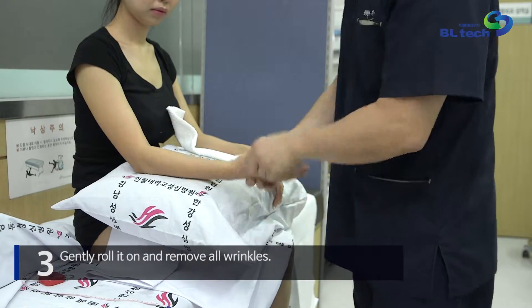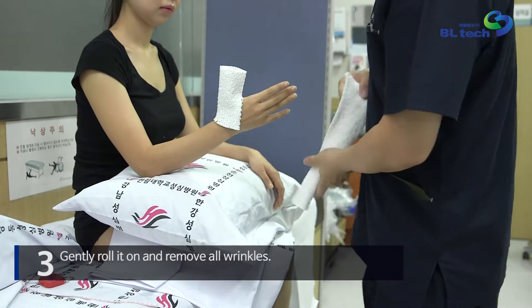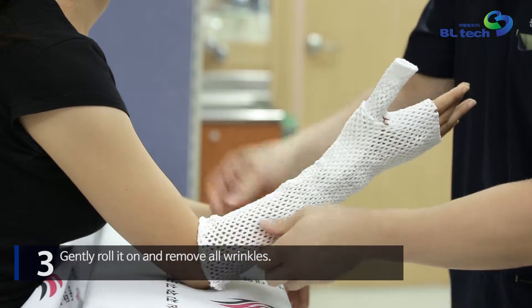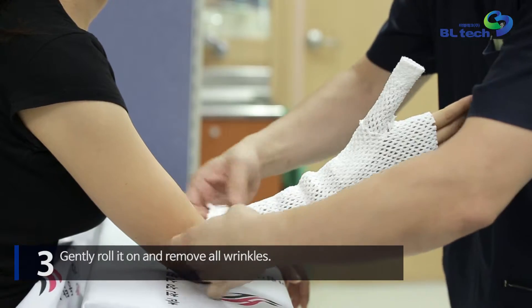Gently roll it on and remove all wrinkles. Since Neal Underpad acts as a buffer to protect the fractured limb, no additional padding such as cotton bandage or stockinette is recommended for ideal performance of Neal Underpad.